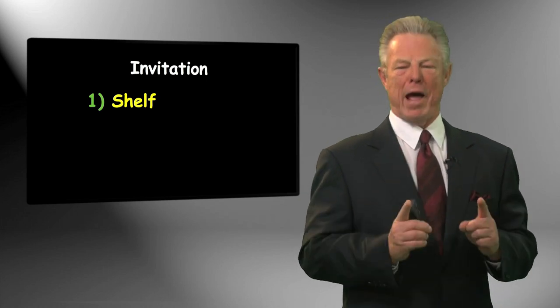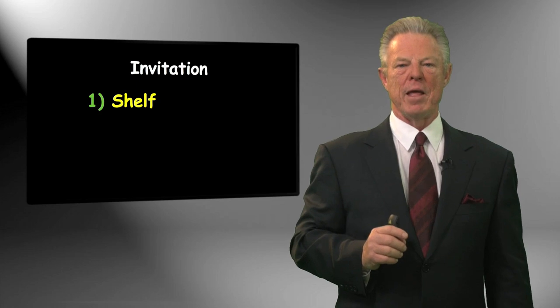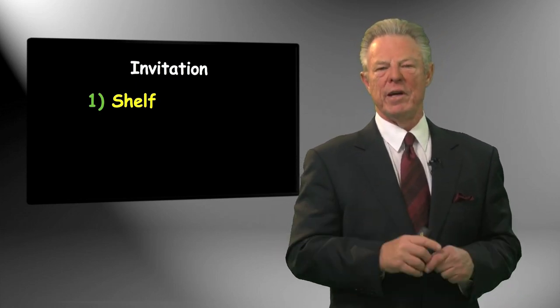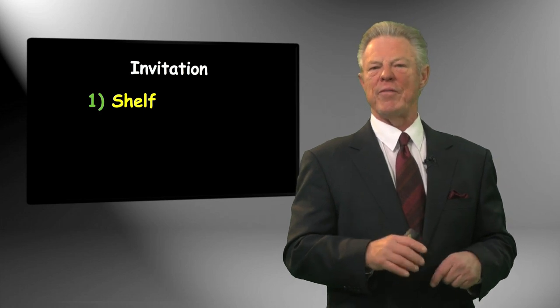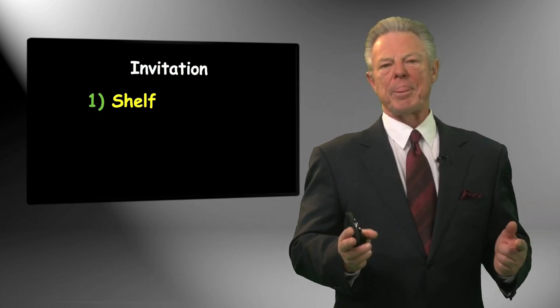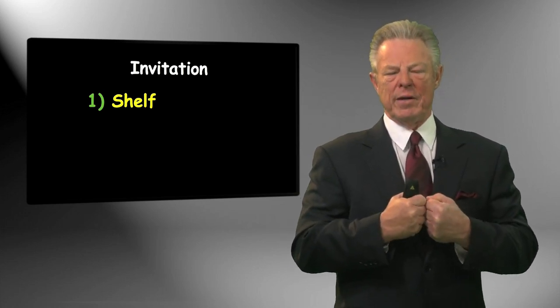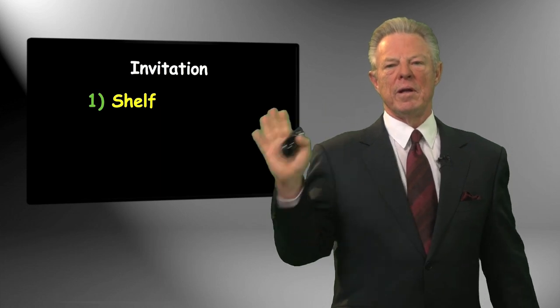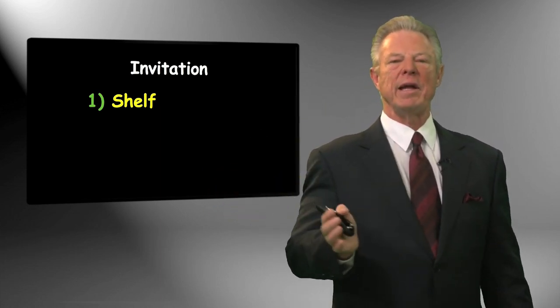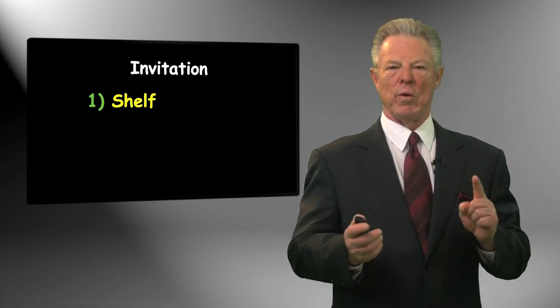One is to buy one package, X1, 2, 3. Put it on the shelf where you can remember where it is. The next time you are uncomfortable in making your shape, regardless of the rotary instrument system you have, and they all have value to some degree, some more than others. When you feel uncomfortable, uneasy, I don't feel right, then stop, go to find the shelf, the X1, 2, and 3, let it run and paint, and notice what you notice.